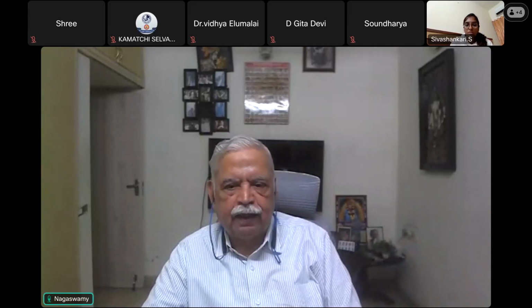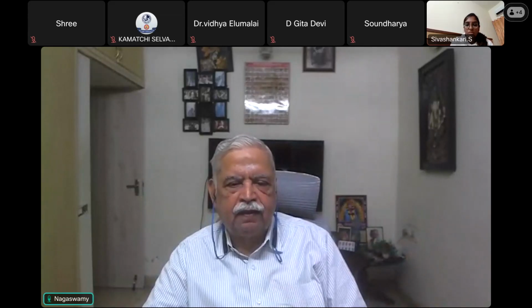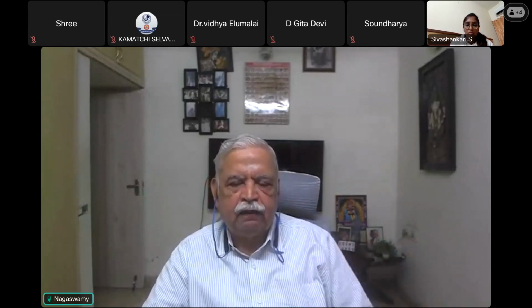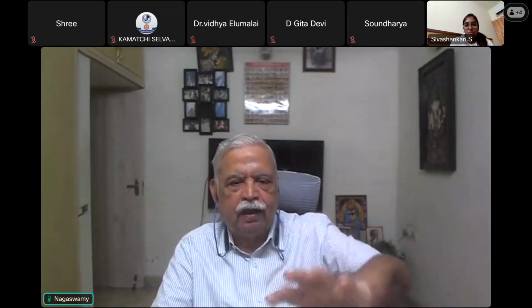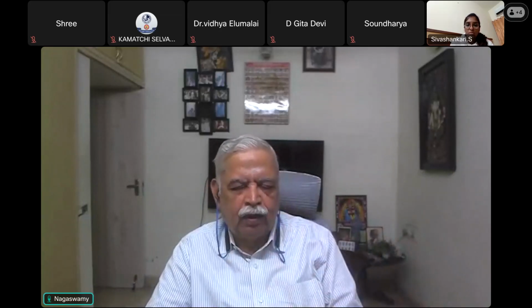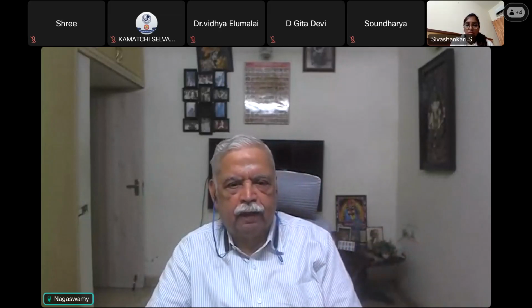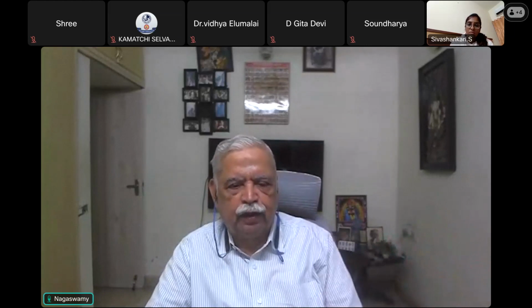So the purpose of mechanical ventilation is to maintain proper oxygenation in the patient, at the same time eliminate carbon dioxide and keep normocapnia. This is the purpose. This can be achieved by delivering a set tidal volume to the patient. Whenever an emergency patient comes to you, these 3 years you worked in ICU and put the patients on ventilator and managed them, isn't it? So what are all the parameters you want to set before you start ventilating a patient mechanically with a ventilator in ICU? What are all the parameters you will go and set in the ventilator that you are going to use?